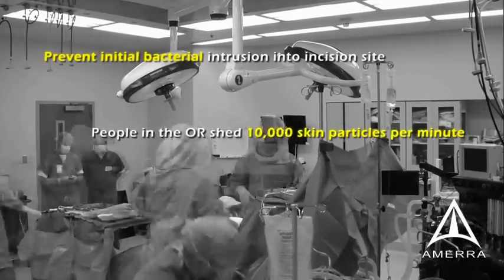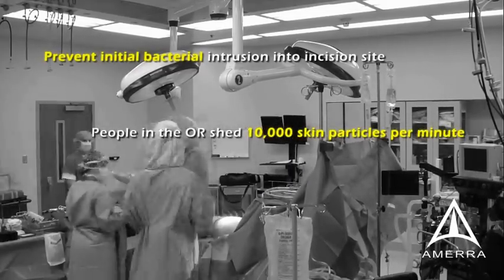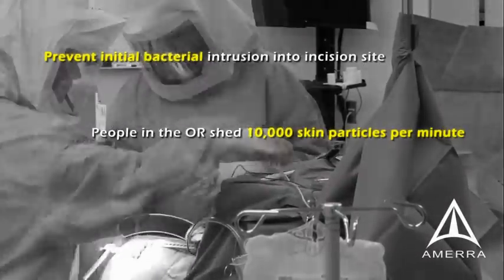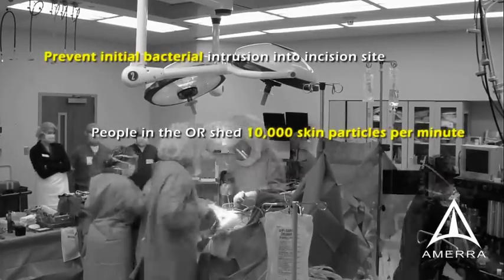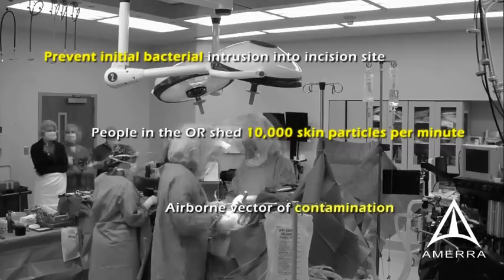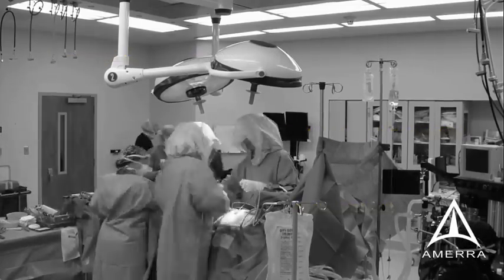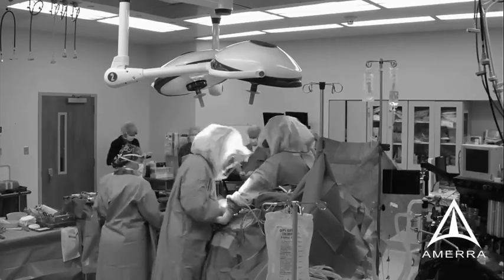People in the OR shed 10,000 skin particles per minute, and studies show that bacteria on these particles of skin may cause surgical site infections after prosthesis implantation. Although not detectable by the human eye, these airborne particles can be present in significant numbers at the incision site, particularly when factoring in the numerous sources of air disruption in a busy operating room.